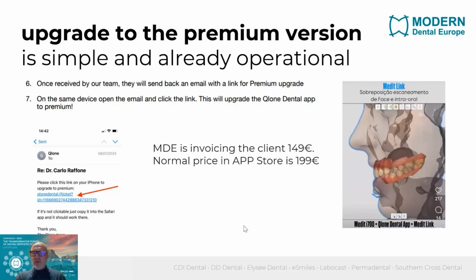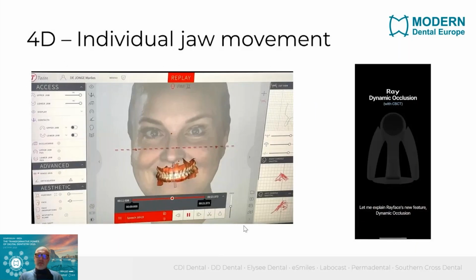So really, really interesting, this new app, using, of course, AI and algorithms to filter out the movement of your phone and also the movement of the patient's face when performing the face scan.